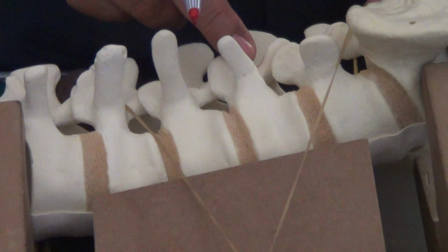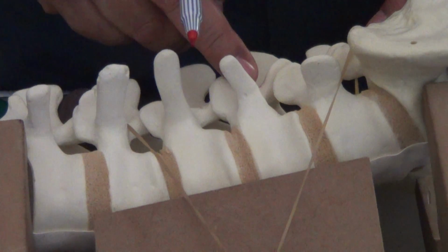Now you can turn around here and you look where the pedicle is. This happens to be right at the center of the pedicle there. So that's what the entry point is.